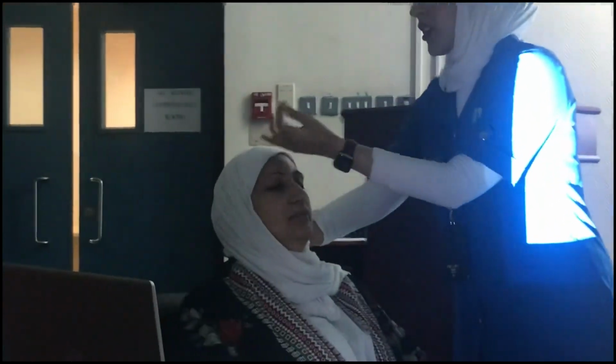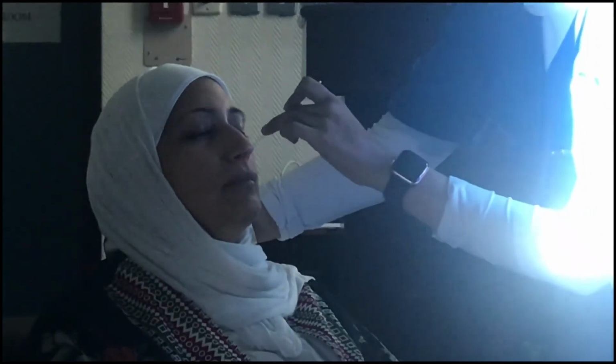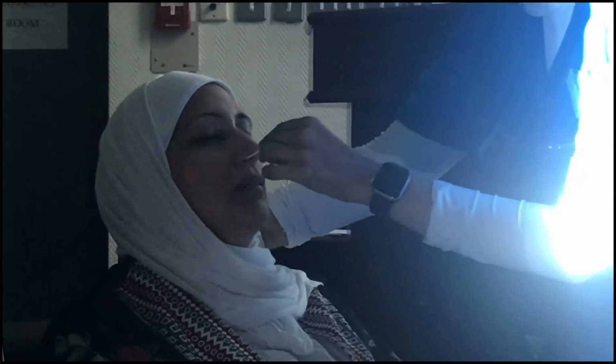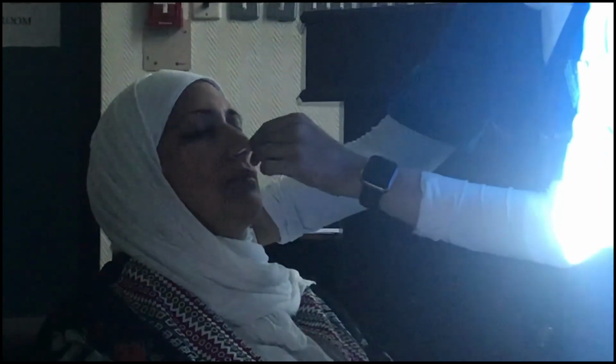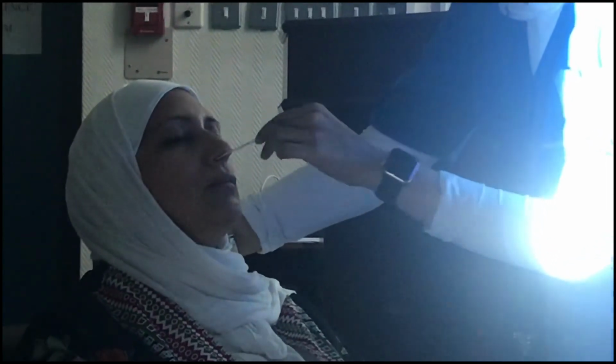Always support your head. I'll take it from here. You go all the way. Always push the tip down. Always push it down. When you go, always push it down till you reach the resistance. Then you rotate it. Leave it 5 to 10 seconds. I am on the nasopharynx now. Just rotate it and then take it out.